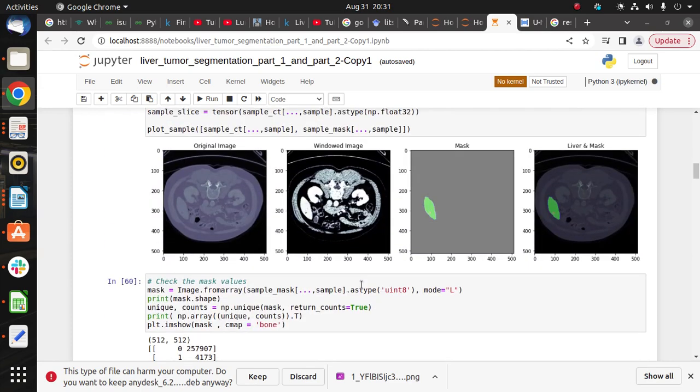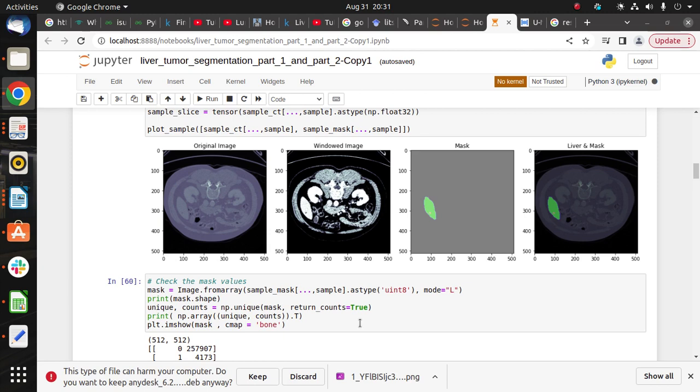After that, convert the original image into the windowing image to remove the irrelevant organs from the original image. That makes the liver and tumor regions clean for segmentation. After that, do the plotting on the sample slice where we can see the original image, windowing image, mask image, and the liver image.